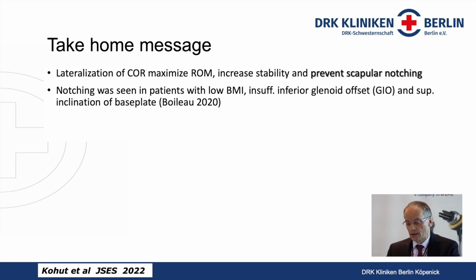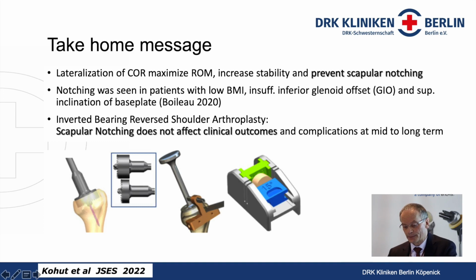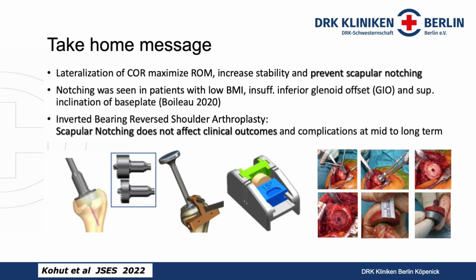Pascal Boileau, we saw this paper before in this first presentation. Pascal Boileau saw notching with low BMI, insufficient inferior glenoid offset, and superior inclination was seen in these cases, but we think scapular notching does not affect clinical outcome with this inverted bearing reverse shoulder arthroplasty, and complications. But now we can add our next step. We are now also able to build this bone graft, and this is also a case from my hospital, and it's very easy to remove that, and more I use that.